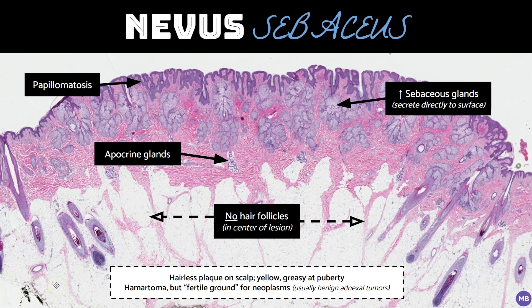The last entity I want to cover is nevus sebaceus, which is actually a hamartoma but is often included when discussing sebaceous tumors due to the prominent sebaceous component. Clinically, it is a hairless plaque on the scalp which is present at birth. When the patient reaches puberty, the effects of sex hormones cause enlargement of the sebaceous glands, including those that are part of the lesion, which makes it appear more prominent and greasy. This is a nice low-power diagnosis. You can see papillomatosis and an increased number of sebaceous lobules, which secrete directly onto the skin surface without an associated hair follicle. Hair follicles are absent, which is really quite striking in this photo. In addition, sweat glands are often apocrine instead of eccrine — and thinking back to normal skin histology, apocrine sweat glands are normally only present in the anogenital region, axillary region, and eyelids. Although this lesion is non-neoplastic, it is not uncommon to see neoplasms arising within it. Benign adnexal tumors are most common, but rarely epithelial and adnexal malignancies can occur.